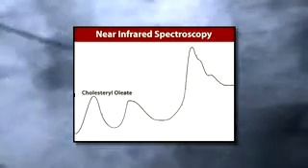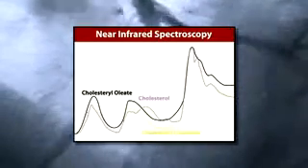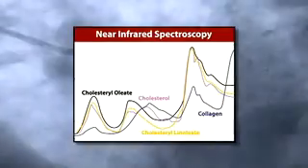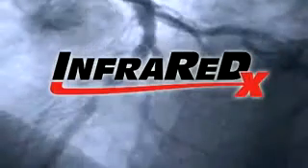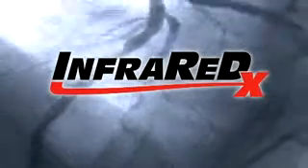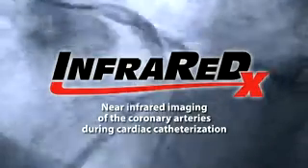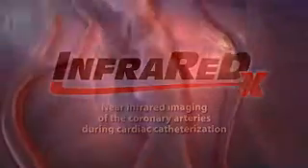Near-infrared spectroscopy is a well-established analytical tool frequently used to evaluate chemical composition of unknown substances. Infraredics has developed a novel system that can perform near-infrared imaging of the coronary arteries in patients undergoing cardiac catheterization. Let's examine this new approach to imaging of plaques.